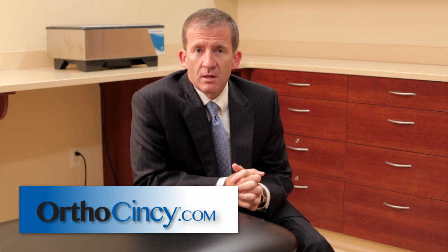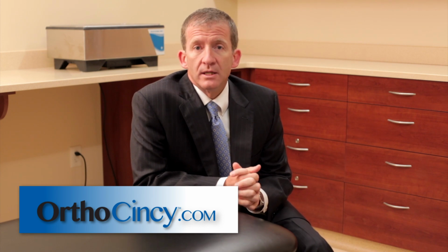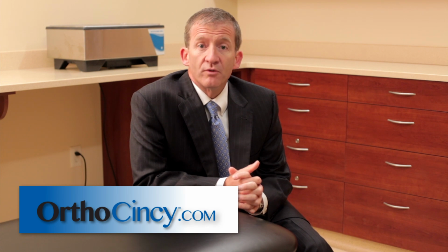Ankle arthroscopy has come a long way in the past 20 years. We now have access to the entirety of the ankle joint, both from the front and the back of the ankle joint, and we can treat disorders such as loose bodies or cartilage damage, ankle sprains, and even ankle instability or looseness of the joint with arthroscopic techniques.